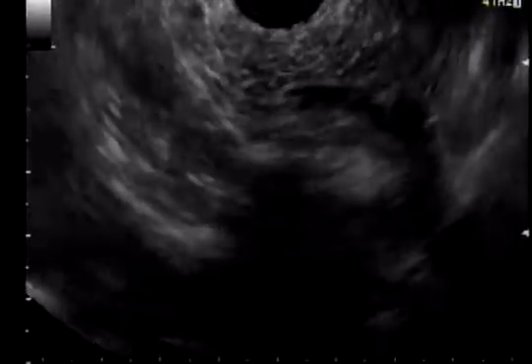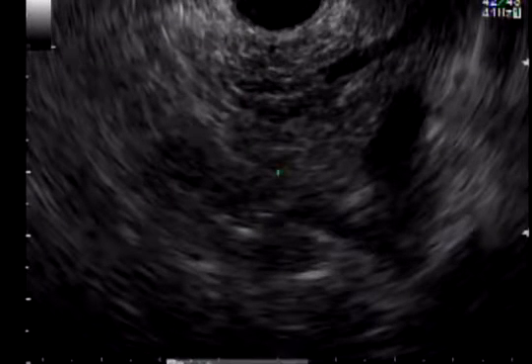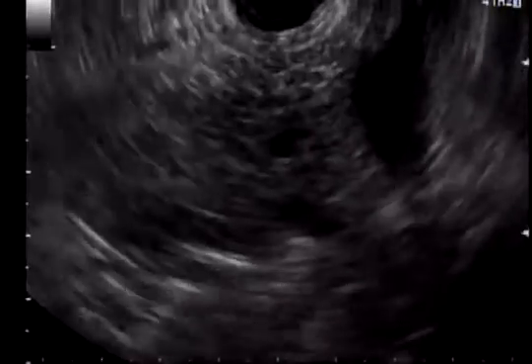The pancreas in this particular patient is a little indistinct, but what we have here is a very nice pancreatic duct. It's a little dilated. This is the pancreatic duct, and I'm going to measure the size of the pancreatic duct, which is approximately 3 millimeters in the tail of the pancreas. Usually the pancreatic duct is 1 millimeter in the tail, but this patient is about 75 years old, and you can expect some dilation. The pancreatic parenchyma is not very homogeneous in this patient.